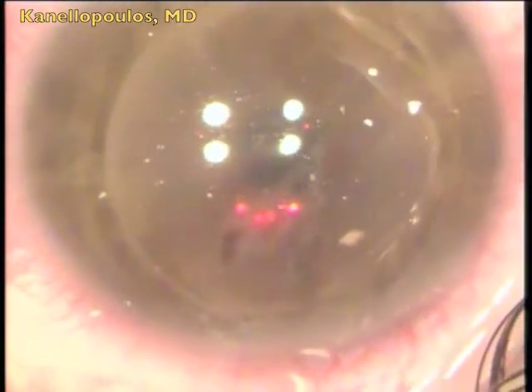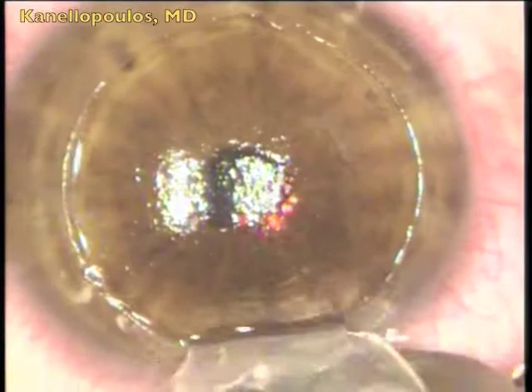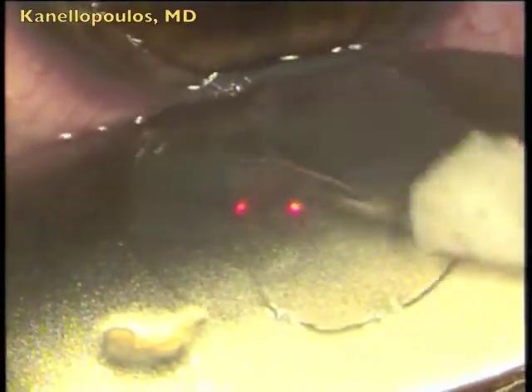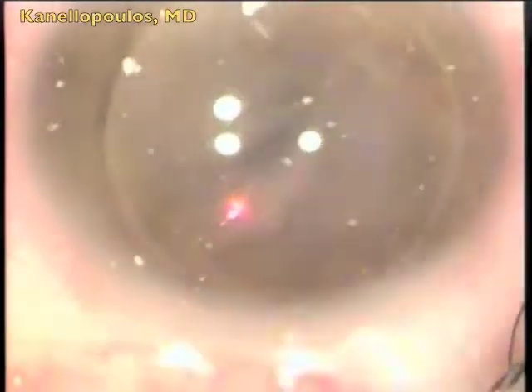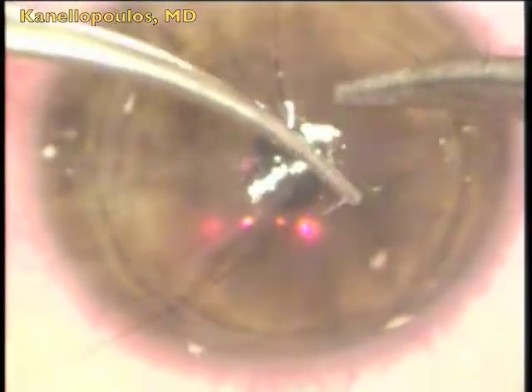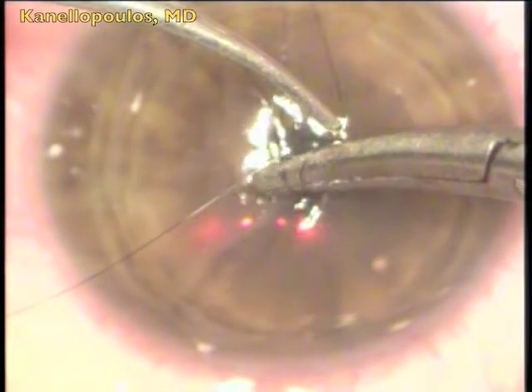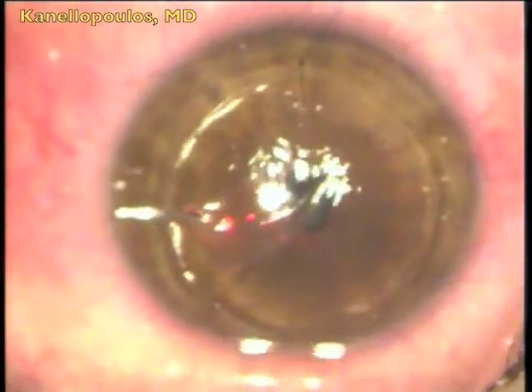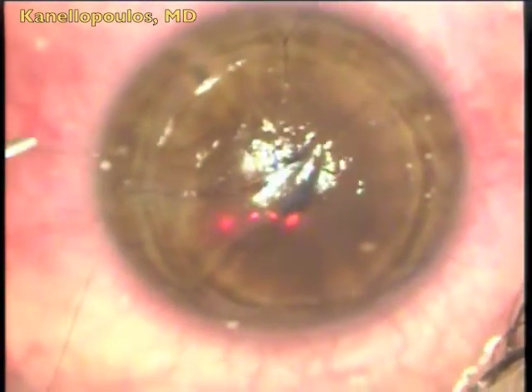Look here centrally — what I now know in retrospect is epithelium. The epithelium gives the illusion that there's still epithelium underneath the flap, as the surface epithelium has remodeled to give that appearance. I'm re-lifting the flap, wiping with a dry wick carefully so as not to tear the flap, making sure there's no epithelium, then putting things back into place. Seven interrupted 10-0 nylon sutures to stretch and anchor the flap tightly so that mechanically no epithelium can enter. This procedure requires great care and should probably be done by a cornea surgeon, as cheese-wiring through the flap may create significant tears.